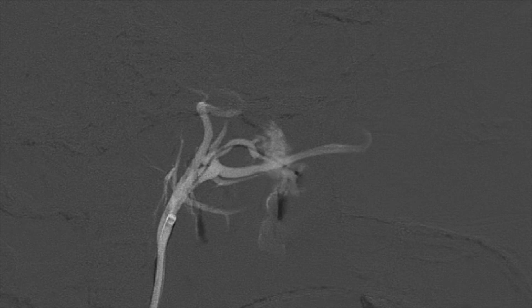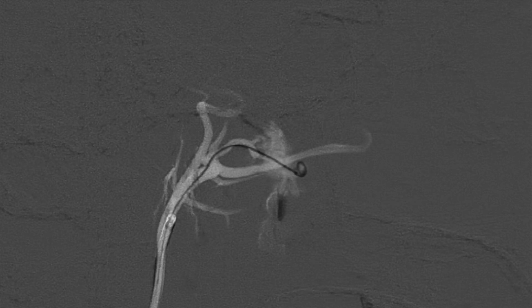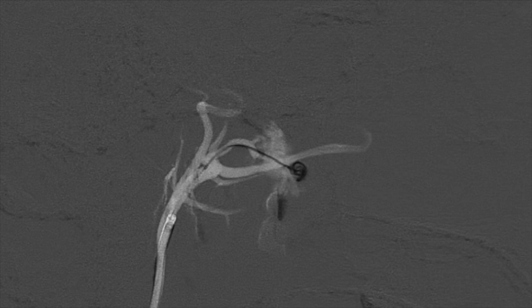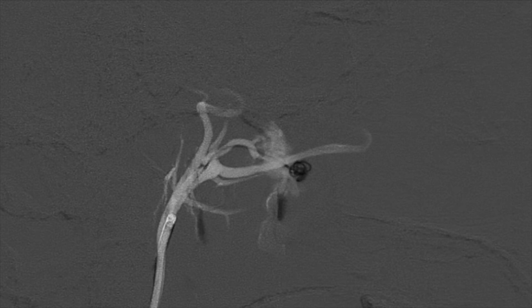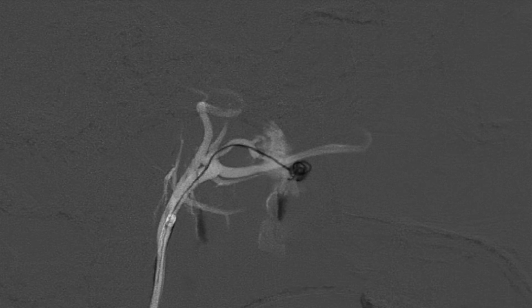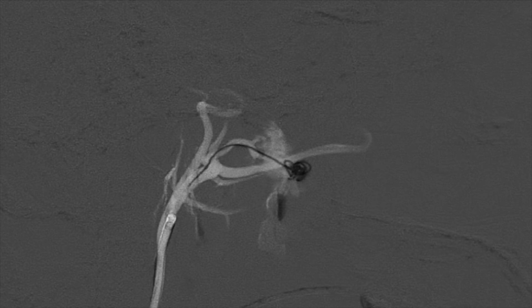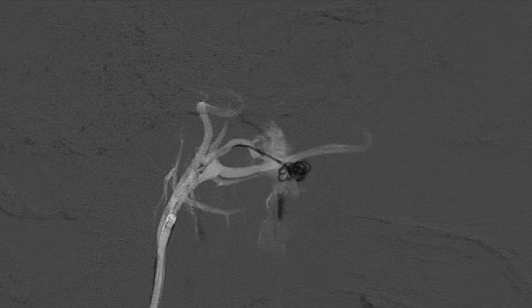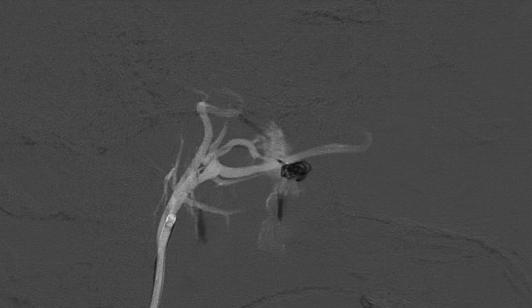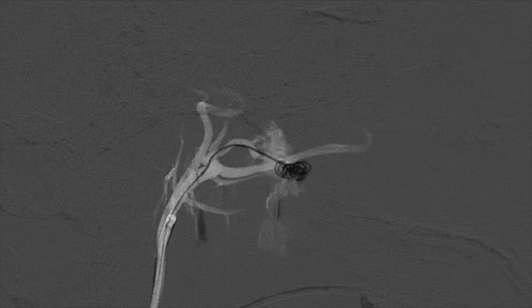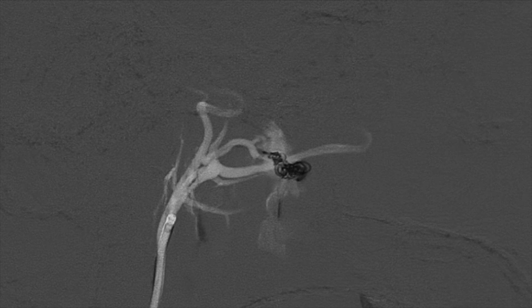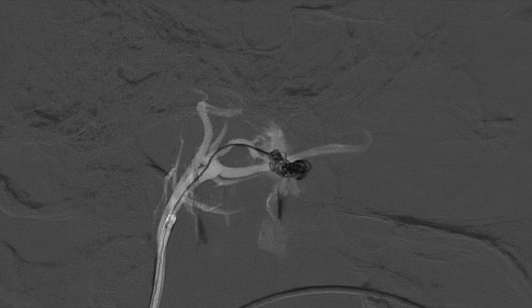Because we knew we were now in the venous pouch of the arteriovenous fistula, we proceeded with coil embolization. The goal was to slow down flow to the fistula and allow for embolization with liquid embolic agents without the risk of agents flying downstream. We wanted to coil from the venous pouch back to the actual feeding artery, then use the liquid embolic agent to achieve a complete angiographic cure. A repeat angiogram following placement of a few coils still demonstrated persistent fistula and opacification of the pterygoid venous plexus.